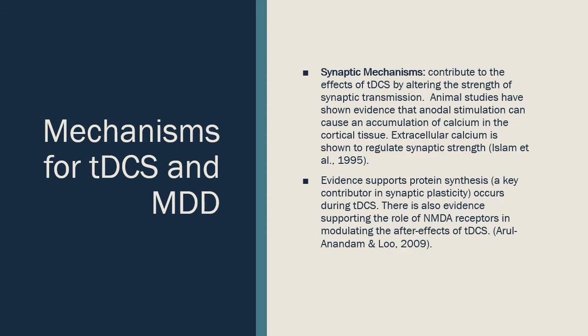Synaptic mechanisms contribute to the effects of tDCS by altering the strength of synaptic transmission. Animal studies have shown evidence that anodal stimulation can cause accumulation of calcium at the cortical tissue, which regulates synaptic strength. Protein synthesis occurs during tDCS, and NMDA receptors modulate the after effects.